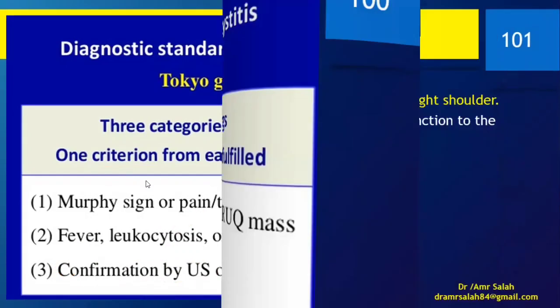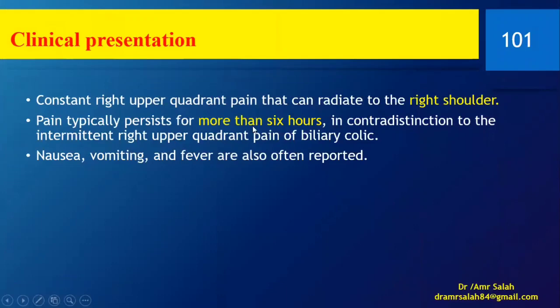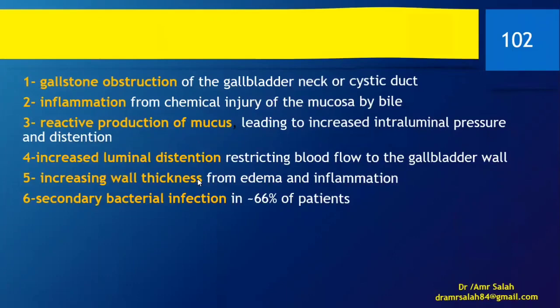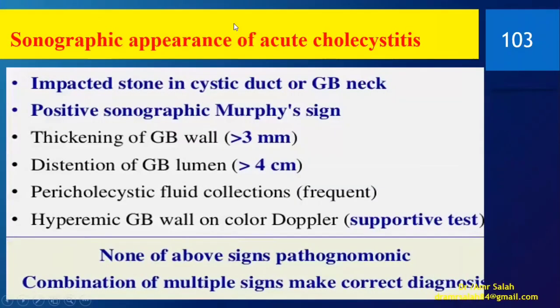Now let's see. Okay, this is what we have seen. All right. Now, what about the sequence of events? Okay, let's see.